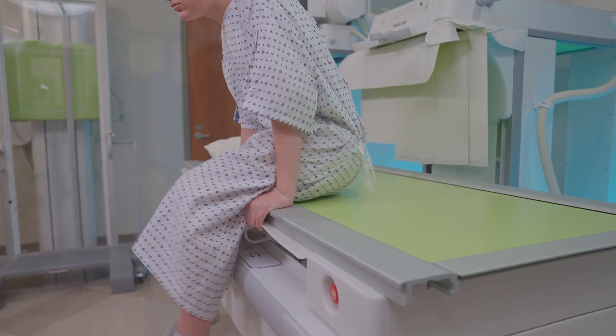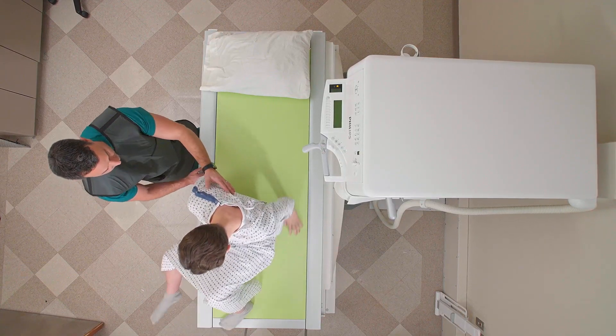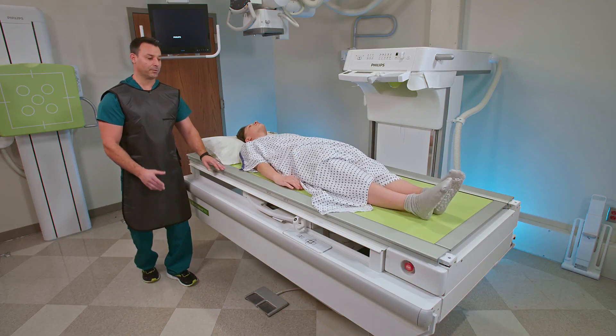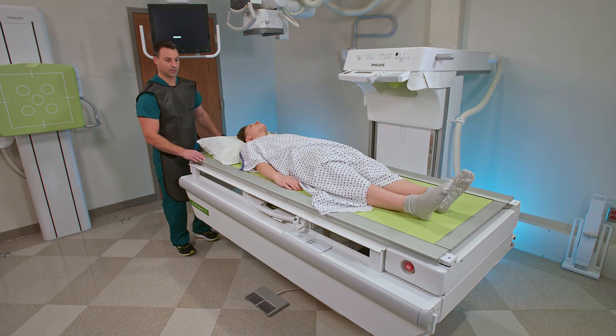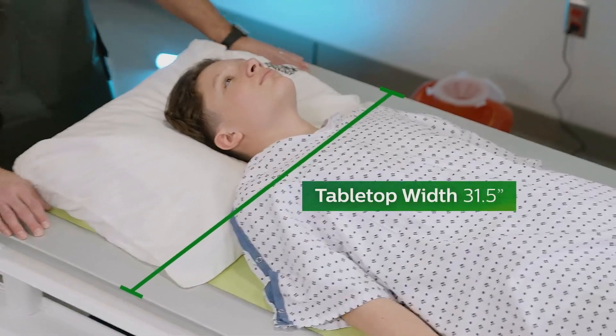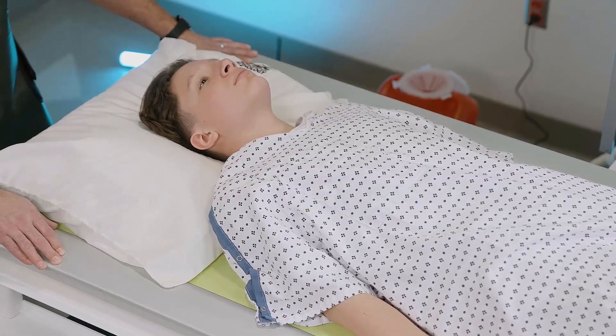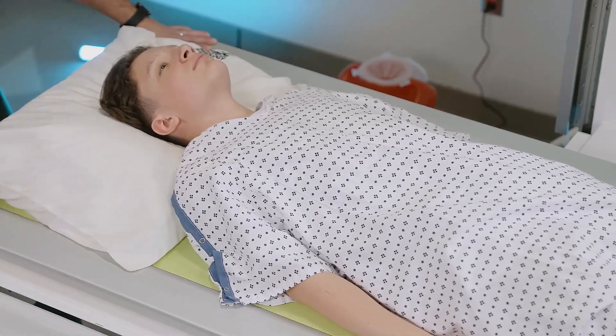I'm going to bring a patient into the room and have them go ahead and lay down. One of the important features of the system is our wider tabletop — it's a 31.5-inch tabletop, so if you have really large patients, it's easier to get them on.